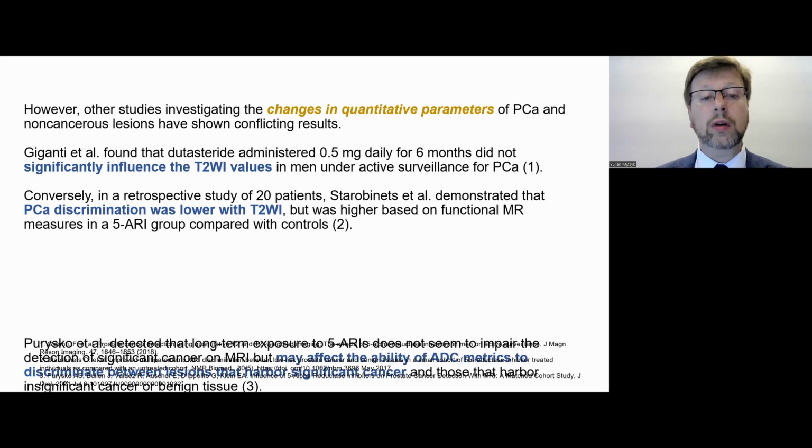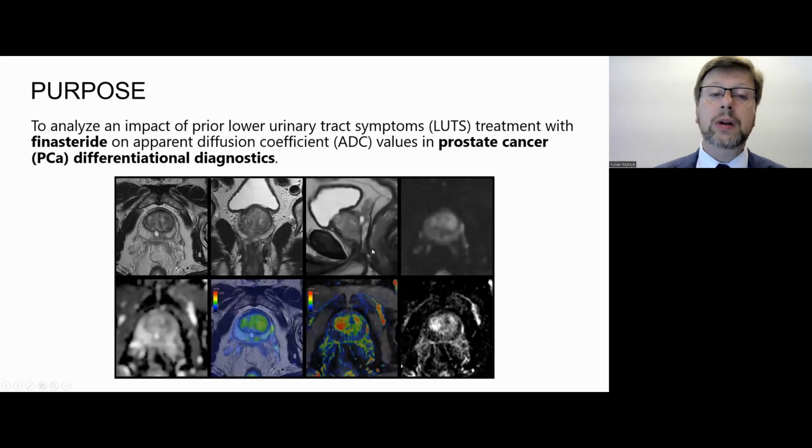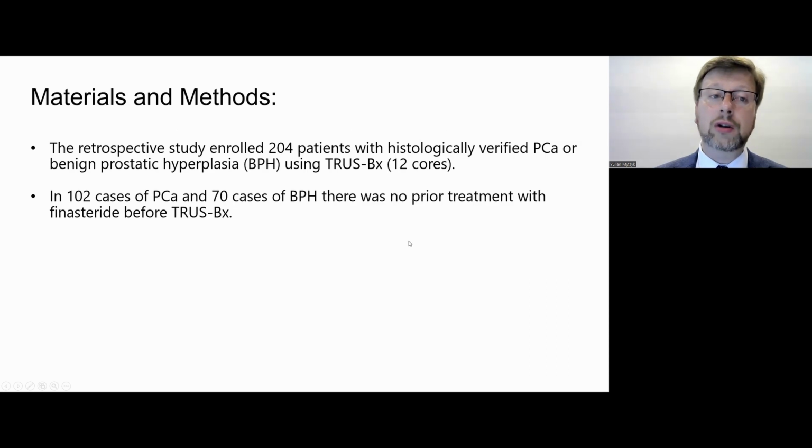For example, one study detected that long-term exposure to 5-alpha reductase inhibitors does not seem to impair the detection of clinically significant cancer, but may affect the ability of ADC metrics to discriminate between the lesions that harbor significant cancer and benign lesions. The purpose of our study was to analyze the impact of prior lower urinary tract symptoms treatment with finasteride on apparent diffusion coefficient values in prostate cancer differential diagnostics.